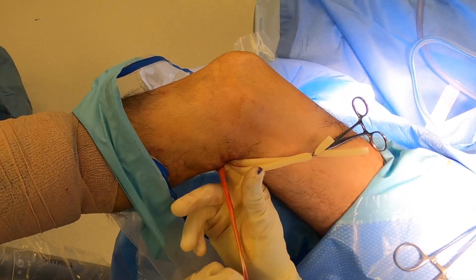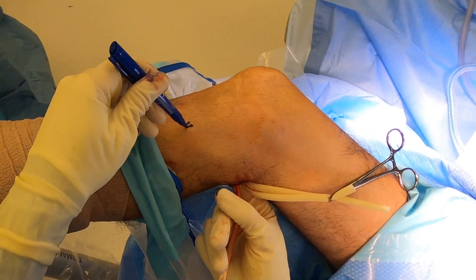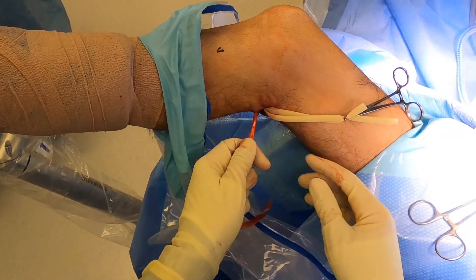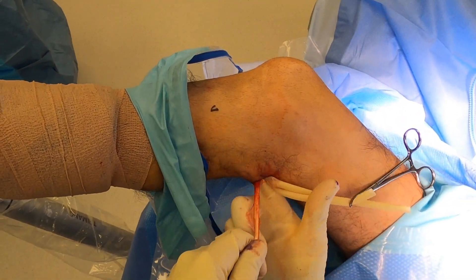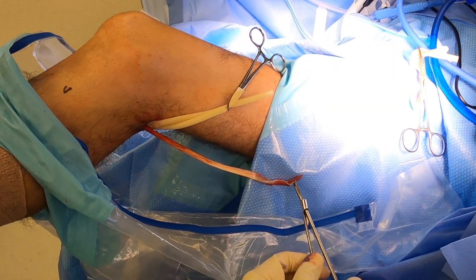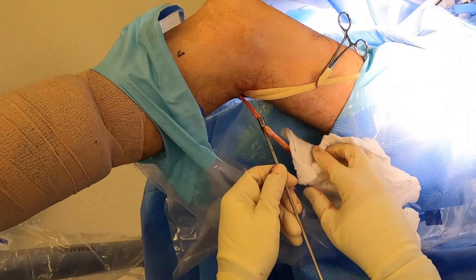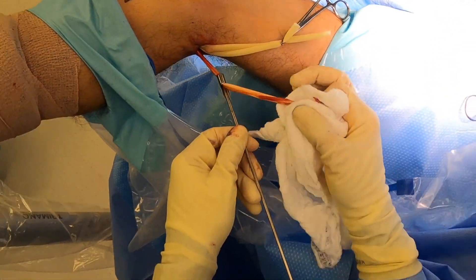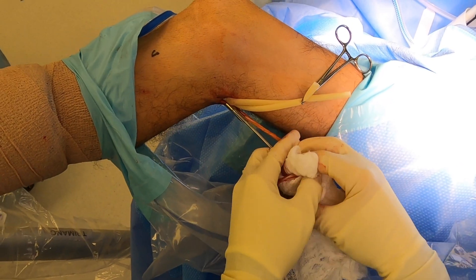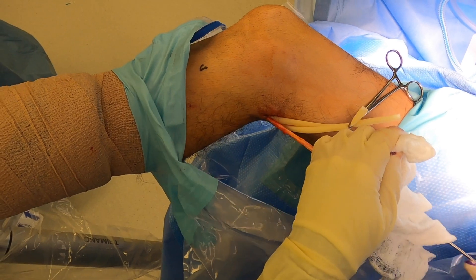The next part is a real advantage of this approach — besides the cosmesis and also being underneath the saphenous nerve, which gives it a much better chance of not having nerve pain afterwards. I run my finger up down to the pes to track the course and draw a target, and I will aim the closed stripper toward it — and now I don't have to really pay any attention to the accessory attachments from the gastroc to the tendon when going antegrade.